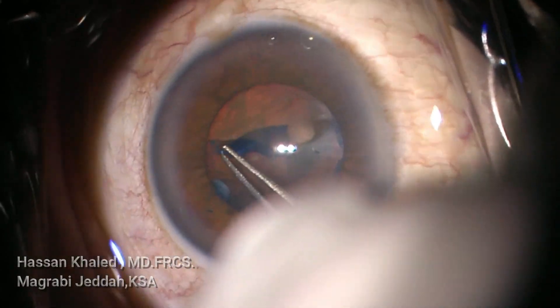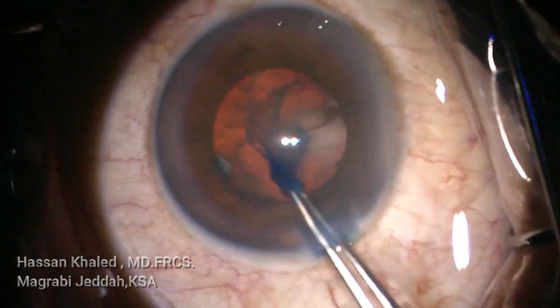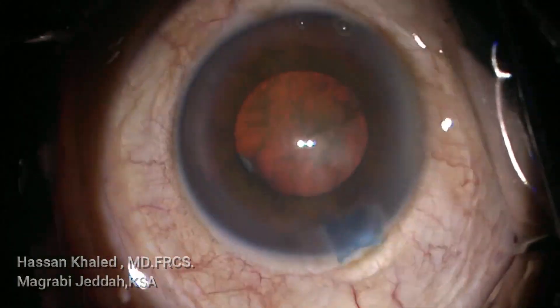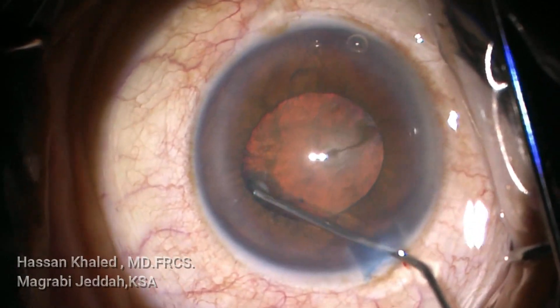Now using the forceps to complete a capsular rhexis of about 5 millimeters — a very nice capsular rhexis, slightly behind the edge of the pupil border.